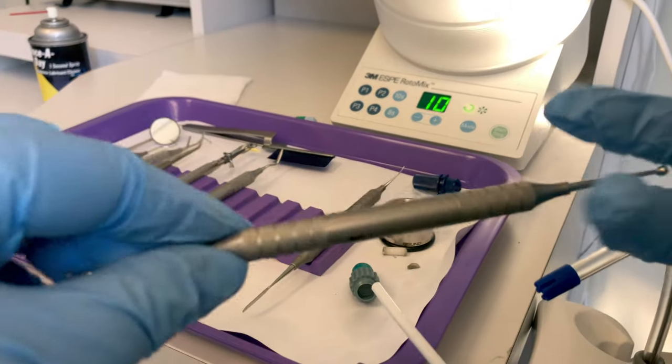Once the restoration is complete, we can give the patient a complete mouth rinse. Caution them on any numbing they received so they don't bite their lip or cheek while still numb. We can give them any post-op instructions on how to care for their new restoration.